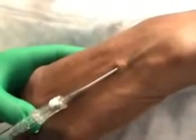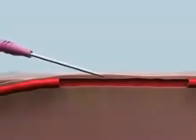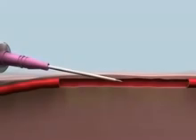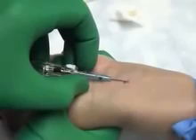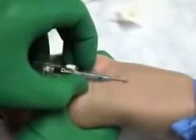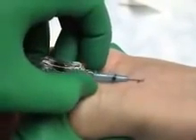When the catheter enters the vein lumen, watch for the initial flashback of blood, which will slowly fill the catheter chamber. Once the metal needle and plastic cannula are in the lumen, lower the catheter so that it is almost parallel to the skin. Hold the end of the catheter with the thumb and index finger of your dominant hand. Maintain tension on the vein and the skin, stabilize the needle, and carefully advance the catheter into the vein. When the catheter has entered the vein lumen completely, remove the tourniquet.